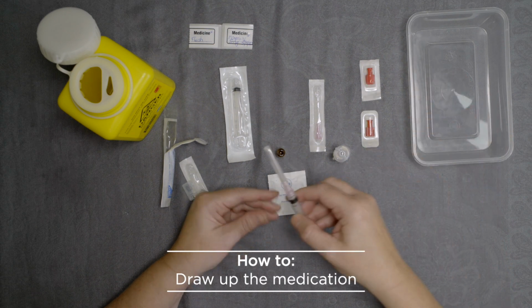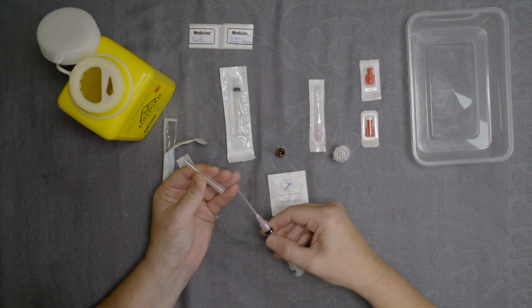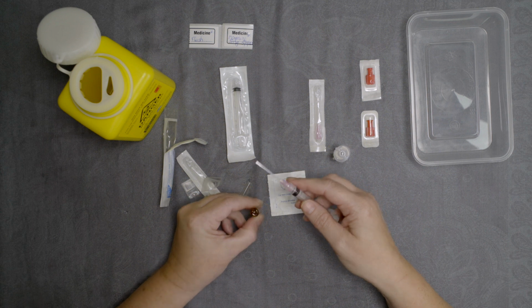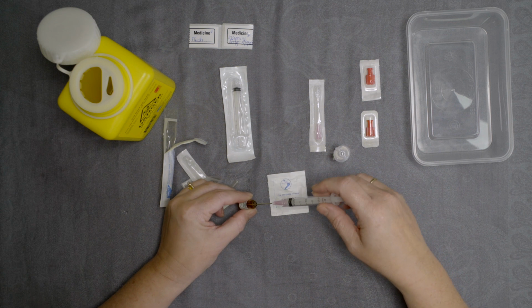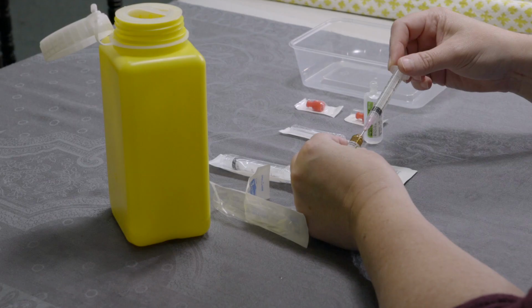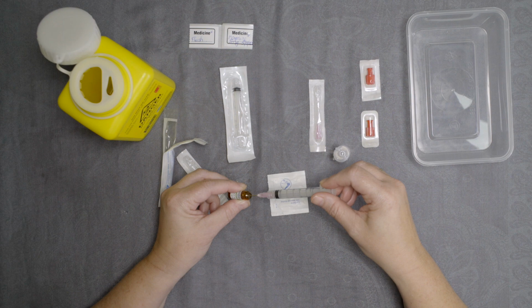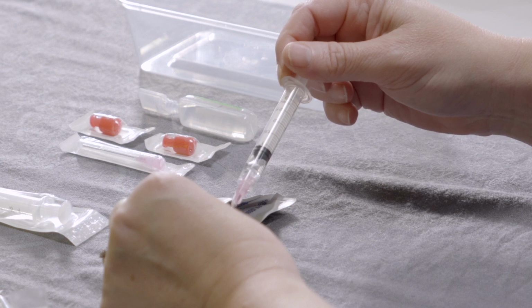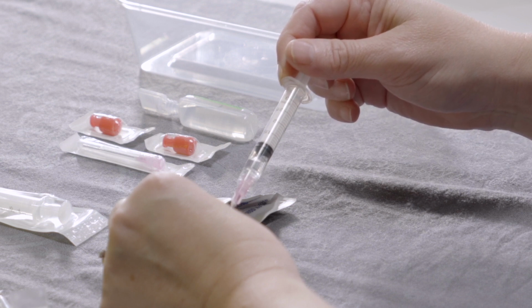Having now opened the ampule, we will show you how to draw up the medication with the needle and syringe. First, carefully take the cover off the needle, which you will notice has a blunt end. Holding the medication ampule in your non-dominant hand, place the needle into the ampule. You may wish to tilt the ampule on an angle. Take note of where the fluid level is and try to keep the end of the needle below this. Now slowly pull back on the syringe to draw the liquid into the syringe.